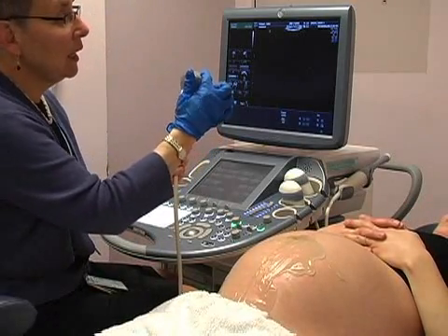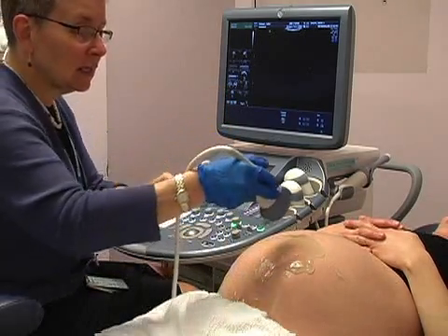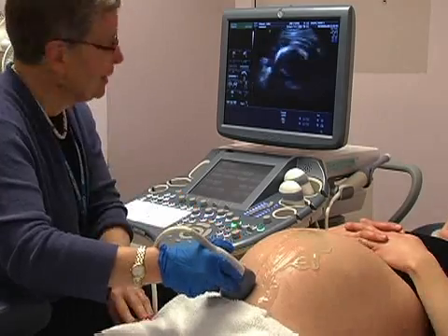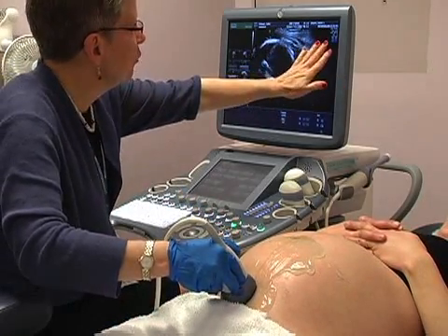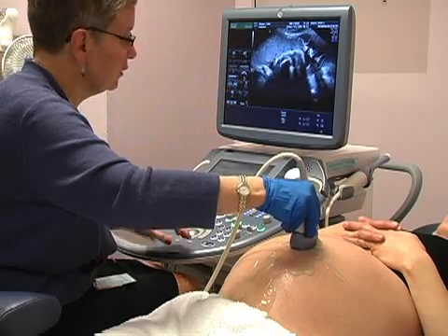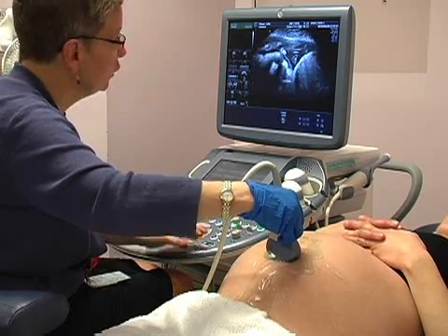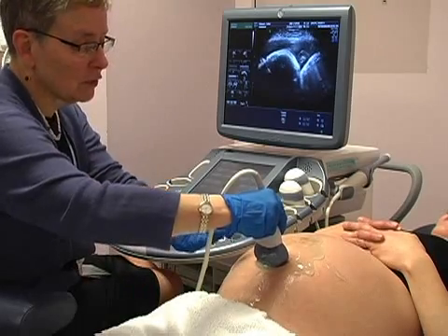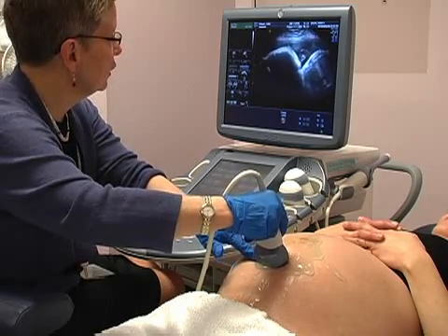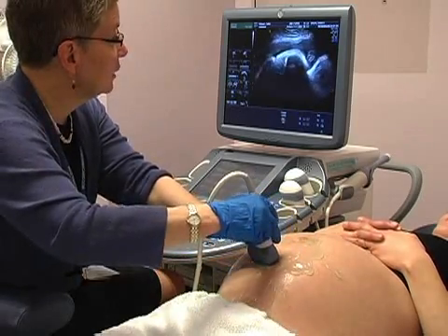I'm going to orient you on the probe again. As we scan the patient, you'll see a knob on the top of the transducer. When scanning sagittally or parallel to the patient's long axis, the knob should be up at the top — mother's feet are toward the right-hand side of the screen and mother's head is toward the left-hand side. When the transducer is turned transverse, the knob should be toward the mother's right or toward me, so the mother's right is on the left-hand side of the screen and the mother's left is on the right-hand side of the screen.